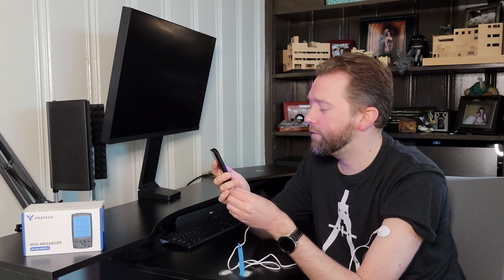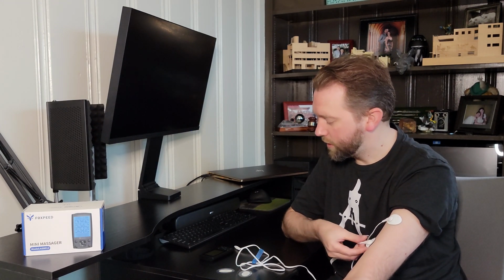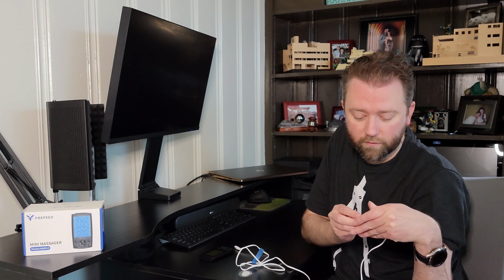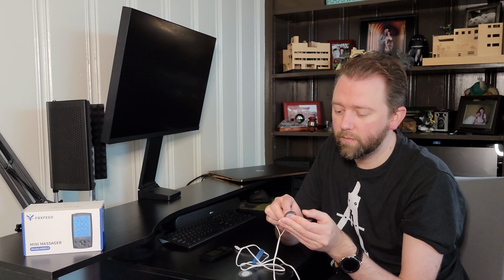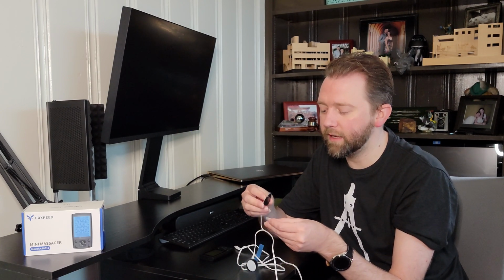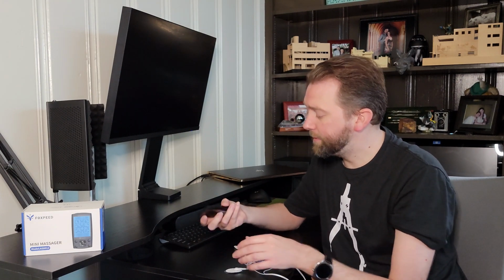I mean, it's pretty straightforward. Then when you're done or when the timer's out, just unplug it. You do want to make sure you got a nice contact so that it works properly. And it works very well. Keep the little plastic pieces here so that you can continue to use these. You can also put a little dab of water. That'll help make them last a little bit longer. And yeah, that's basically it.